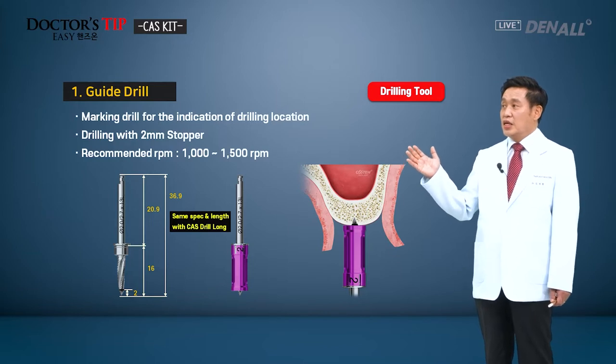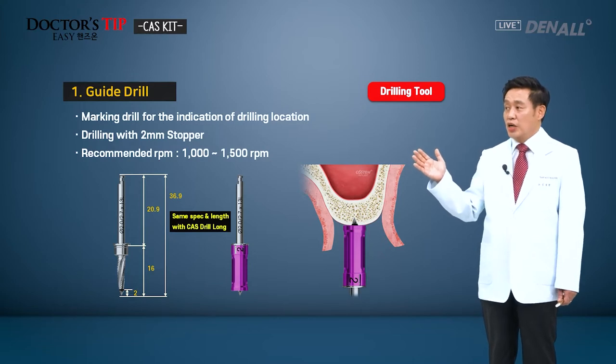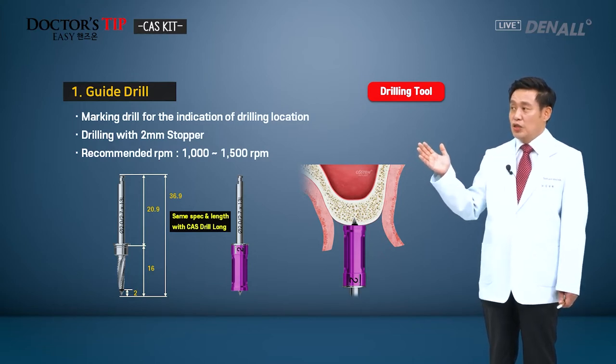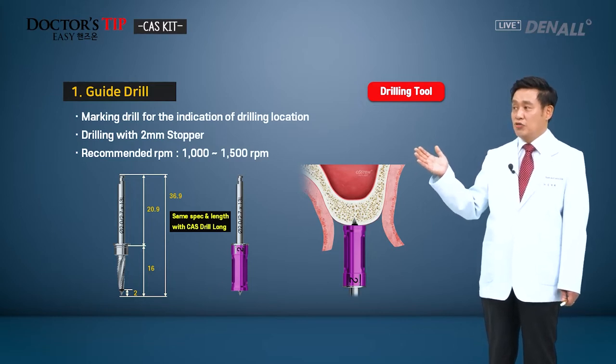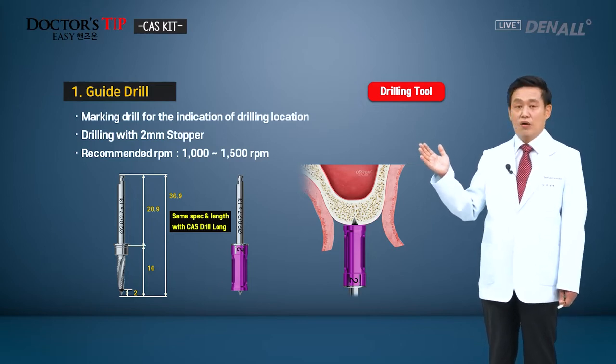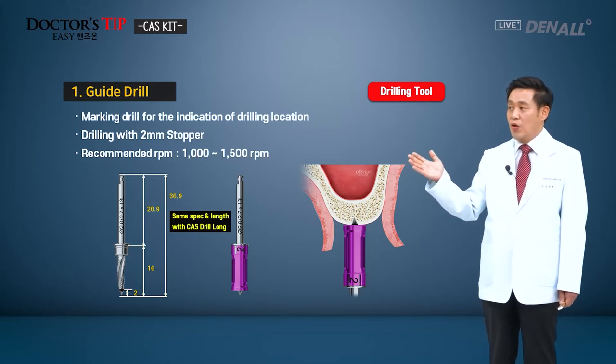First, the guided drill. Basically, it is to mark the drilling location. A 2mm stopper is recommended to do the marking. The recommended RPM is 1000 to 1500 RPM. The length is the same as the CAS drill.